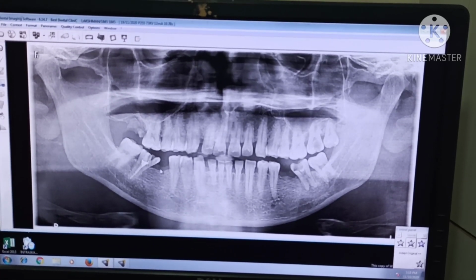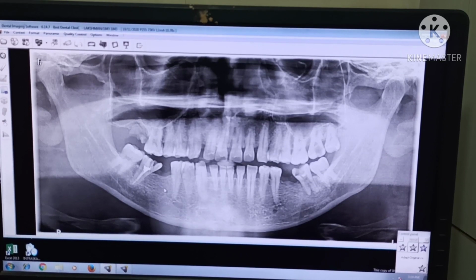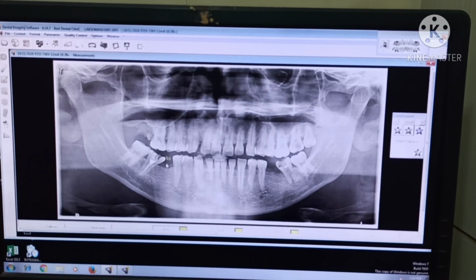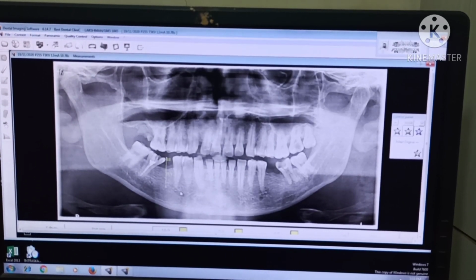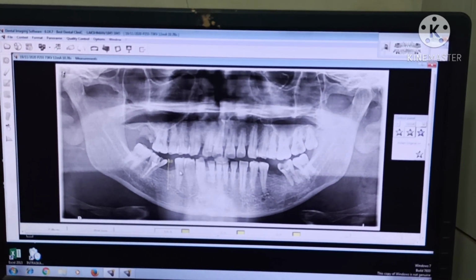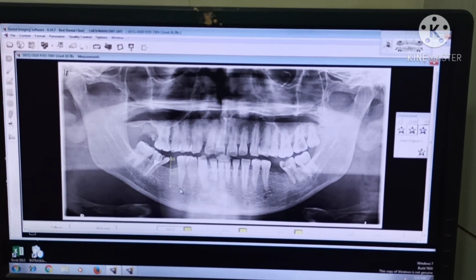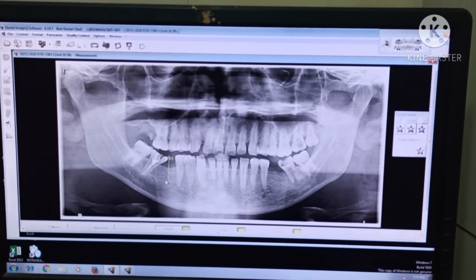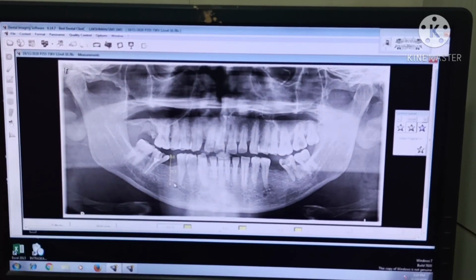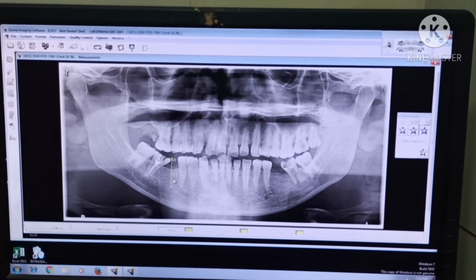So you are going to place 1 mesial implant and 1 distal implant. You have to finalize the location of the implant mesiodistally. Mesially there is no confusion. You can place the implant like this, right? In this angulation, distal to the premolar, not very close to the premolar. The mental foramen is in a favorable area. It is closer to the second premolar, so we don't have to worry about the foramen here. Sometimes the mental foramen is close to the mesial root of the first molar, but here no issues. The bone quality is good.